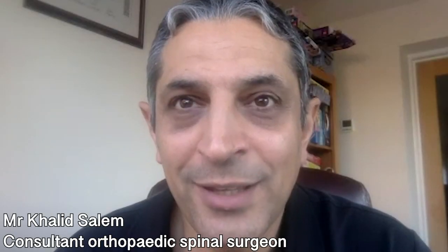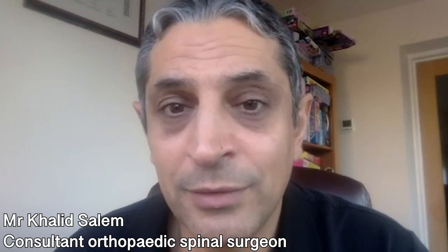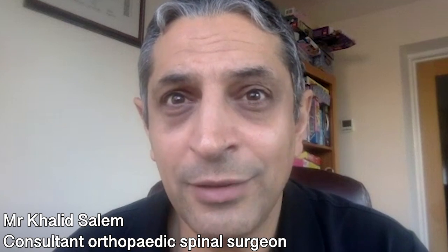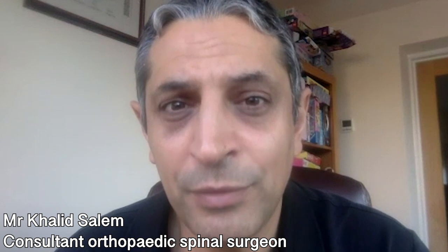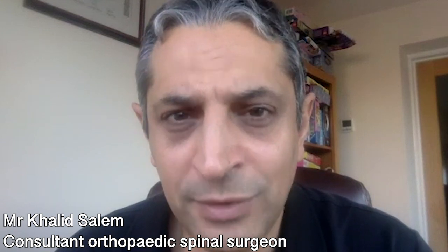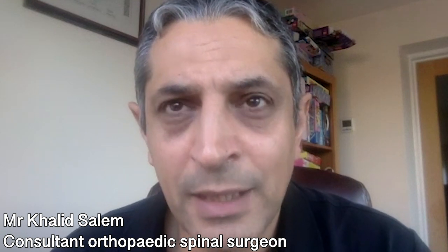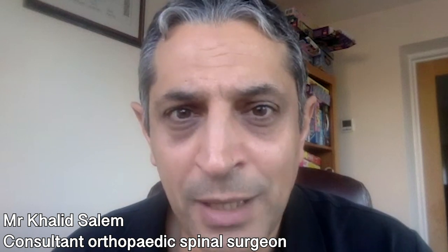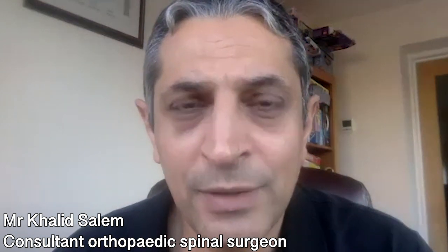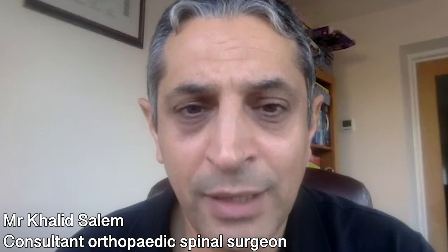Minimally invasive spinal surgery is performed through the use of microscopes, tubes, or special retractors that allow for access to the spine without compromising the surgical objectives and minimize the risk of soft tissue stripping, allowing for quicker recovery.